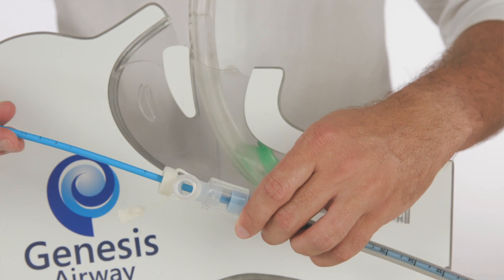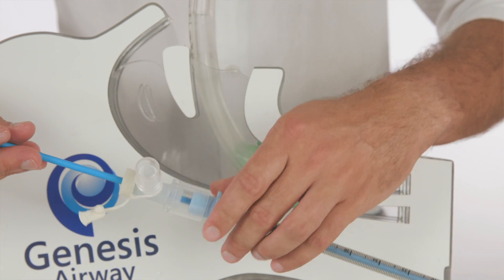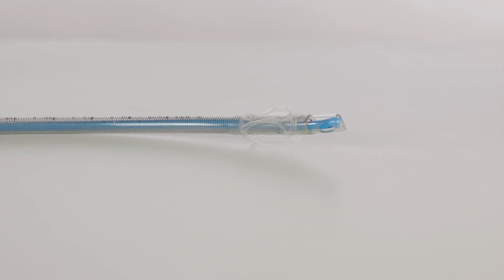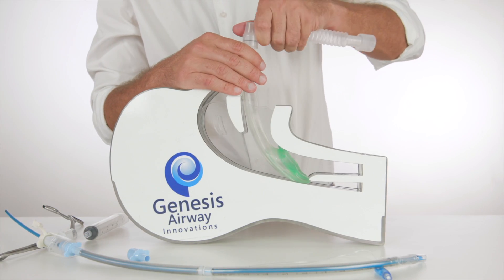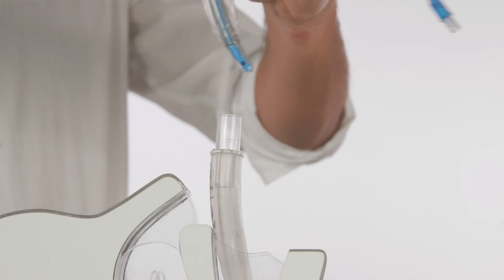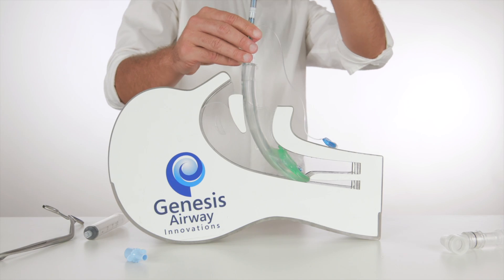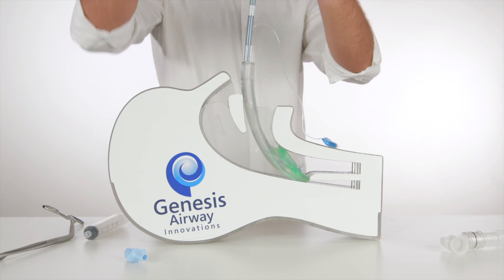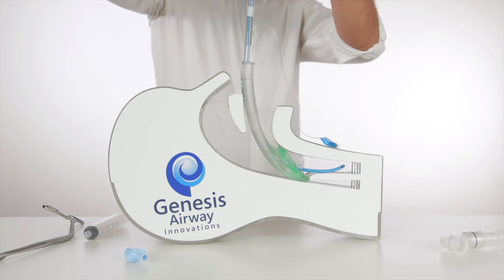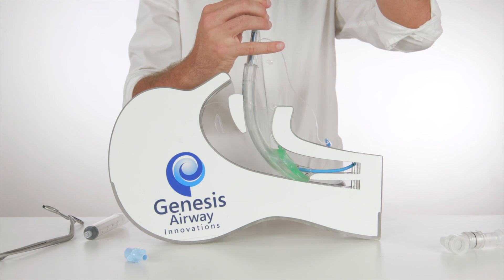We advance the bougie, being careful that the intertube connector does not come apart, and take it towards the tip of the endotracheal tube. The anaesthetic circuit is then removed from the LMA and the tubing set is advanced through the air passage. Once the vocal cords are visualised through the bronchoscope, it can then be advanced through the cords, the tubing is railroaded over the bronchoscope, and the cuff is inflated.